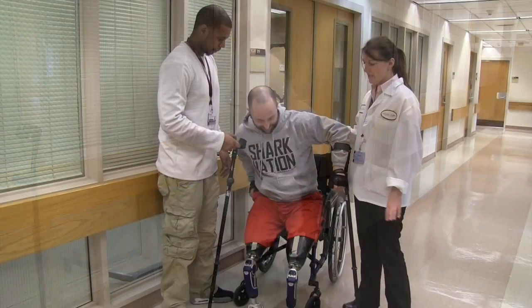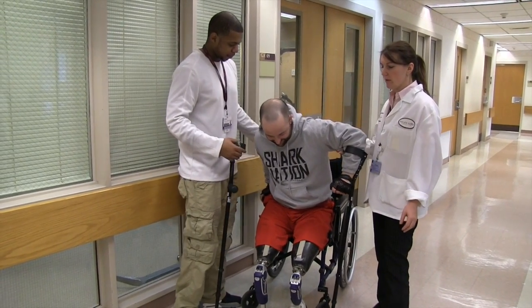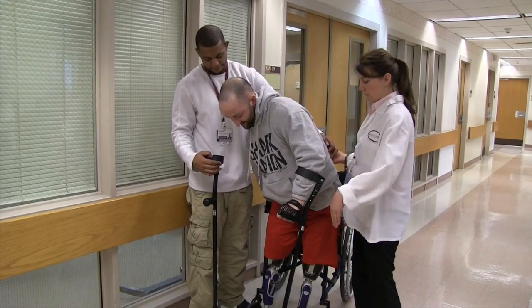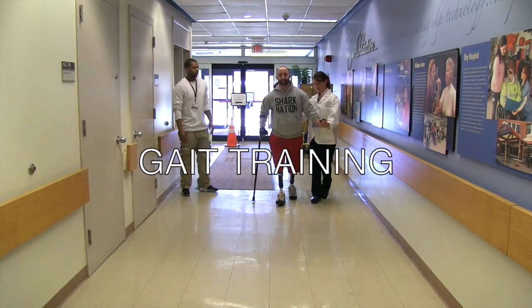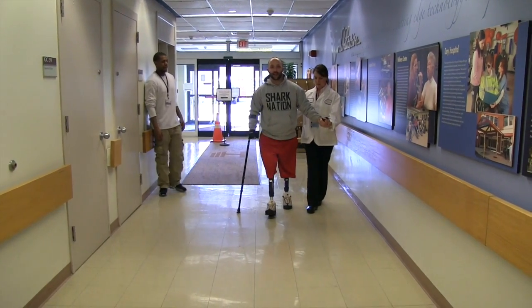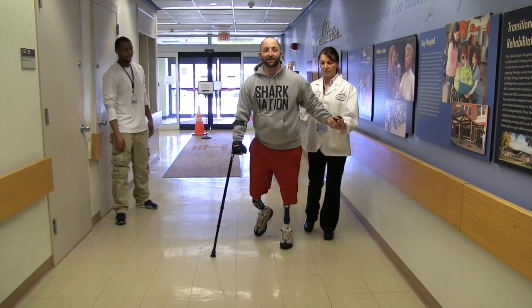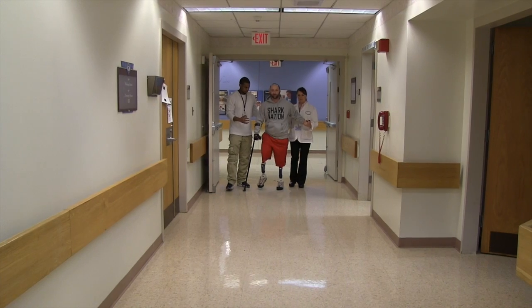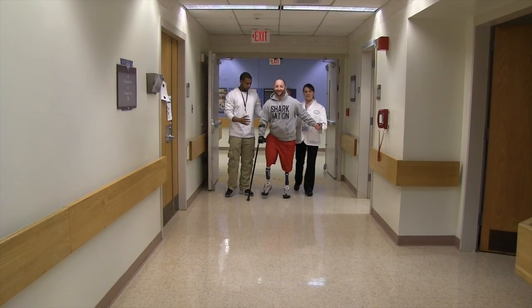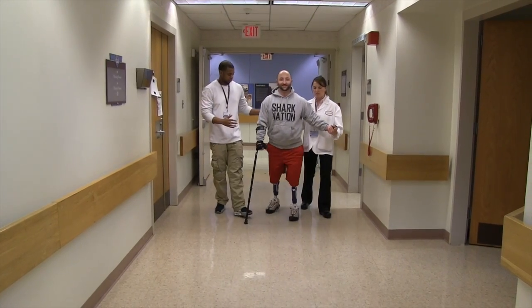Stand up on your arm, Matt. Concentrate and try to come up. And this is still very nice on the feet, so that's good. Left leg — try to control it better.